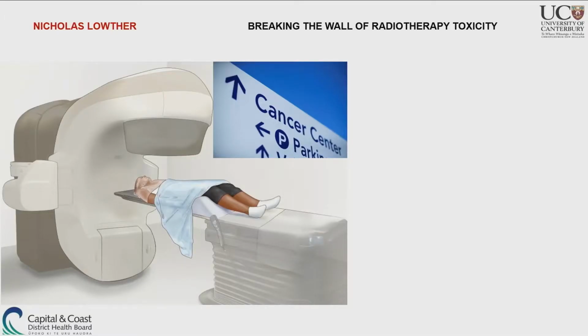At the next appointment, the doctor informs you that you've been prescribed radiotherapy and that the treatment will be delivered over a 6-week period, daily, like this. The machine on the left delivers the radiation while the patient lies on the treatment couch.